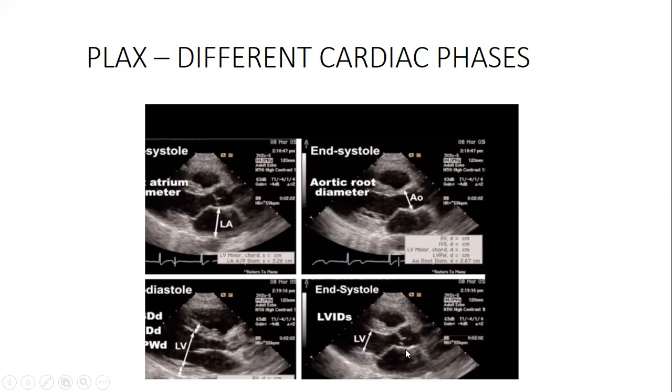And that is why I was explaining that this part is the LVOT. So when this has thickened, it will come as far as this side, to an extent where it will obstruct the LVOT, and you are going to have difficulties for blood to move from the left ventricle to the aorta, because it has hypertrophied. And this is called hypertrophic obstructive cardiomyopathy. It will obstruct this part.